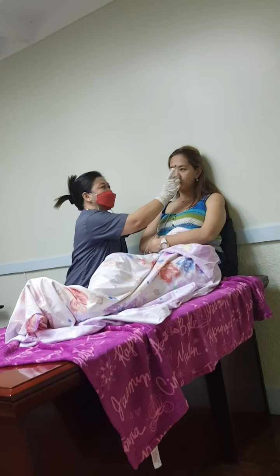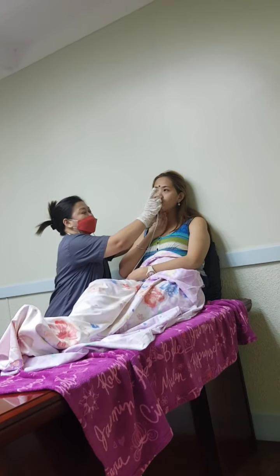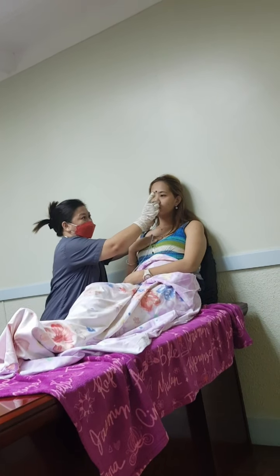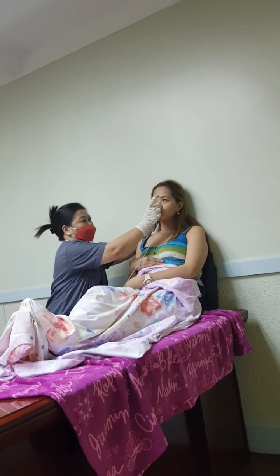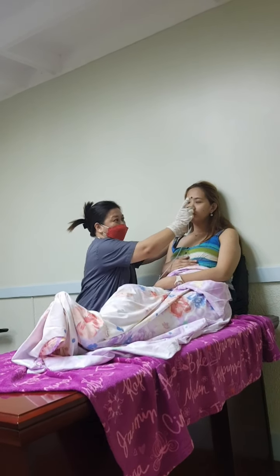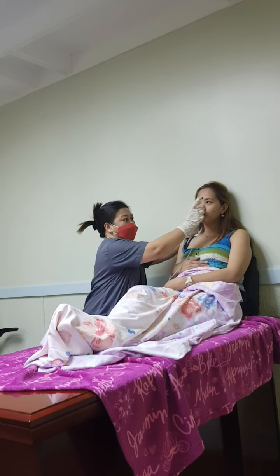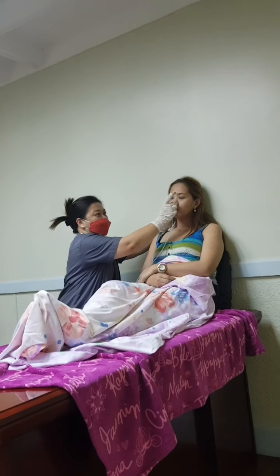Instruct the client to touch her chin to her chest. Ma'am, may you please touch your chin to your chest. Encourage her to swallow even if no fluids are permitted. Swallowing helps advance the tube, causes the epiglottis to cover the opening of the trachea, and helps to eliminate gagging and coughing.